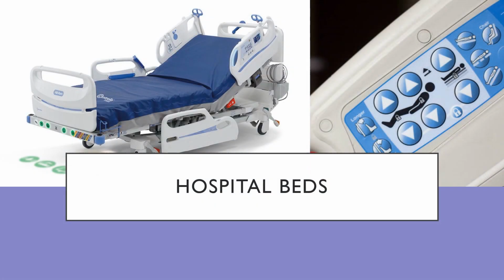Hospital beds are the most convenient equipment to use as they are always already in the room. The controls to assist a patient into more of a sitting position can help reduce burden and getting the patient to sit at the edge of the bed by reducing the amount the healthcare worker needs to lift from supine. This also allows the patient to assist more by reducing the effort it takes for them to come to a sitting position.